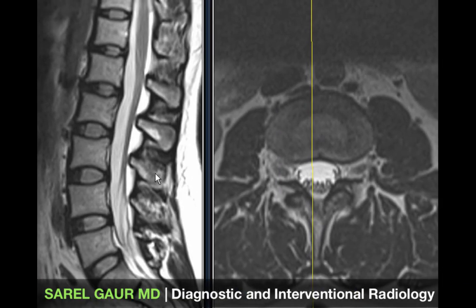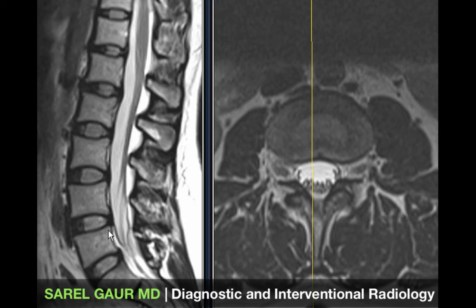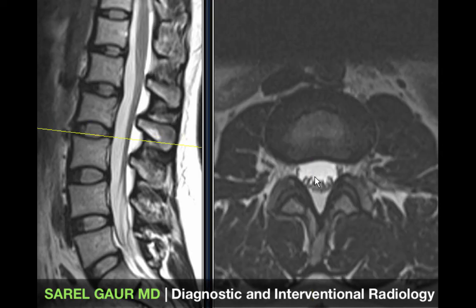Before finishing, let's quickly go over the ligamentous structures of the lumbar spine. On the sagittal plane anteriorly we have the ALL, or anterior longitudinal ligament. Posteriorly we have the PLL, the posterior longitudinal ligament. Lining all the lamina we have the ligamentum flavum, seen very nicely on the axial plane as a low signal structure running along the lamina.